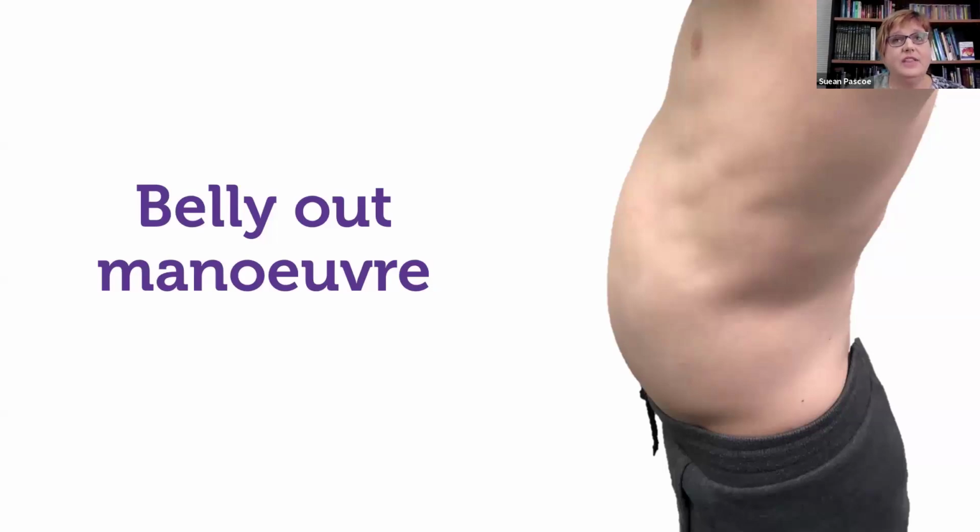And I think the other thing that we do in an ultrasound department is to scan the abdomens in the morning. So they haven't been chewing gum, and they haven't been having lunch, and they haven't been talking all day. So we reduce the bowel gas that way. So, the abdominal patients are usually booked preferably in the morning, and they come fasted, and that all helps to make for better imaging.